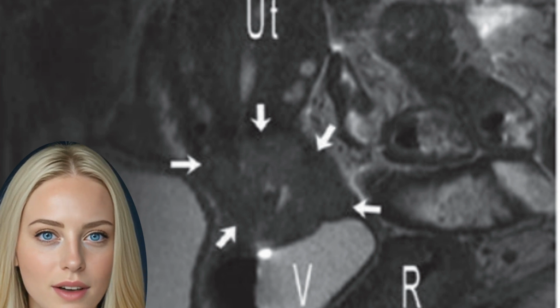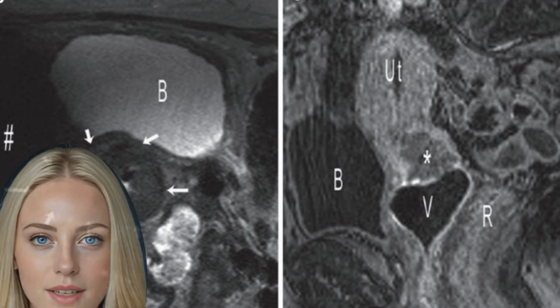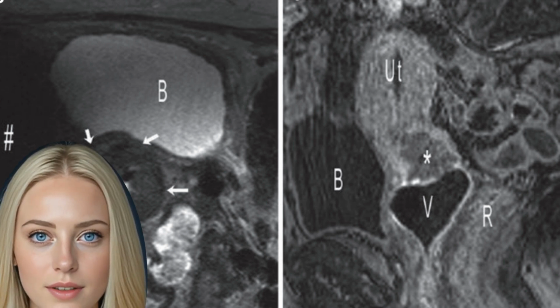Computed tomography (CT). With a multi-detector CT, MDCT, the examination of a region of interest can be performed in axial plane in a short examination time with sub-millimeter resolution. The raw data can be post-processed in any plane with approximately the same resolution.